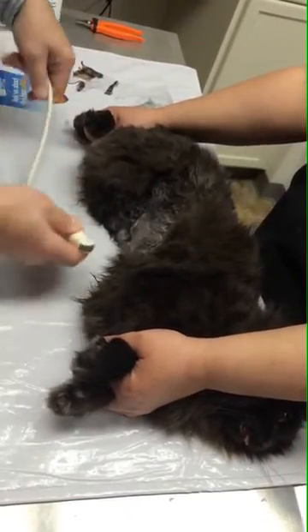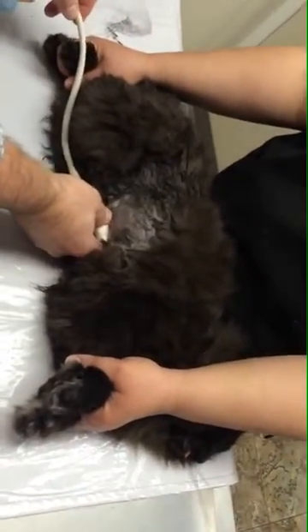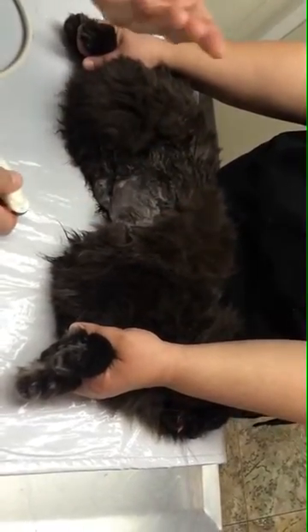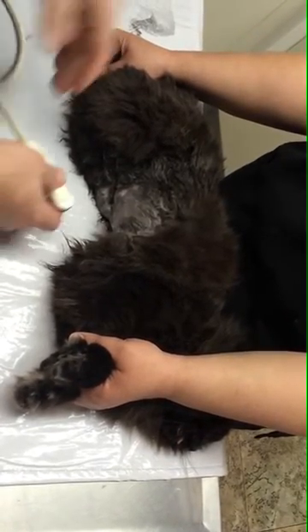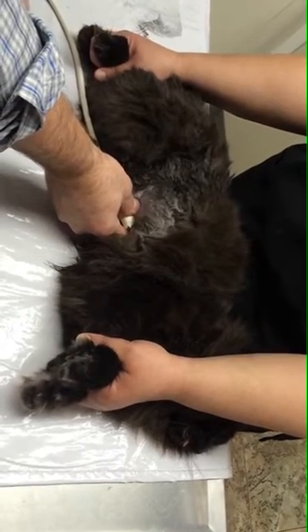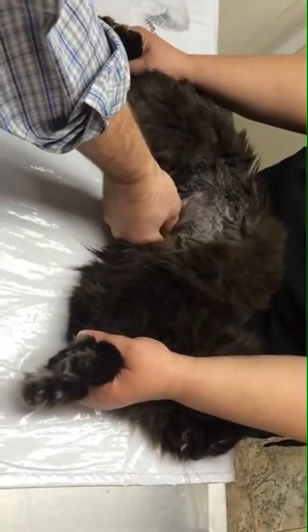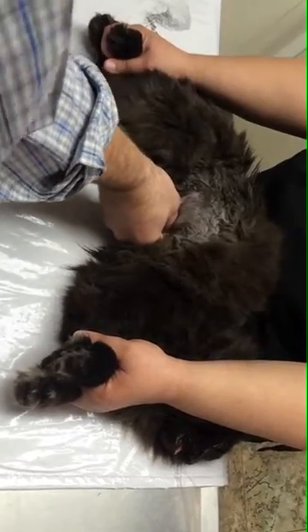In cats, you really have to be lined up with the body wall in order to get the aortic outflow accurately. Otherwise, it's going to be offline. And in order to do proper Doppler, you have to line up the probe and the angle of incidence within 15 degrees theta. In a dog, you typically stay just caudal to the last rib adjacent to the sternum. But in cats, you have to go really high, about a third of the way up the rib cage, in order to be lined up with the aorta.